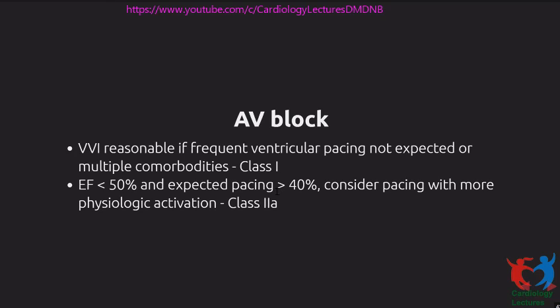Now, in patients with AV block, at least, especially in the current scenario, you have to be alert to the possibility of patients developing pacemaker-induced cardiomyopathy. So what this means is that RV apical pacing especially, but any pacing, even alternate locations in the right ventricle, can result in the development of heart failure or reduced ejection fraction in some patients.